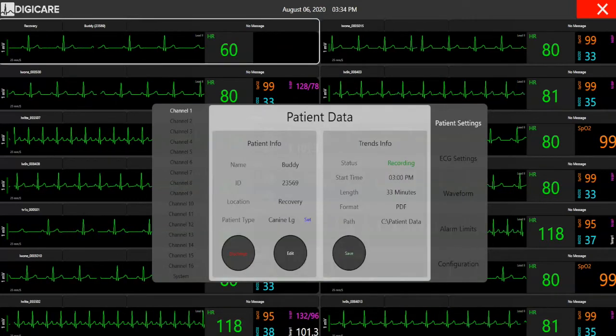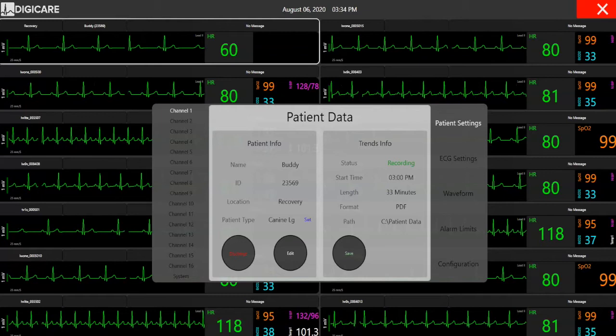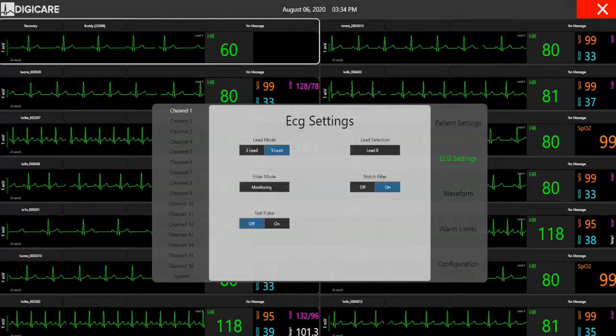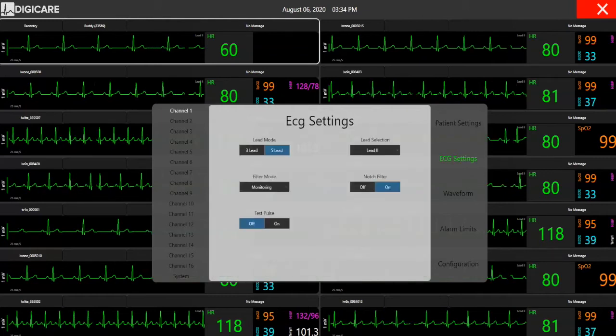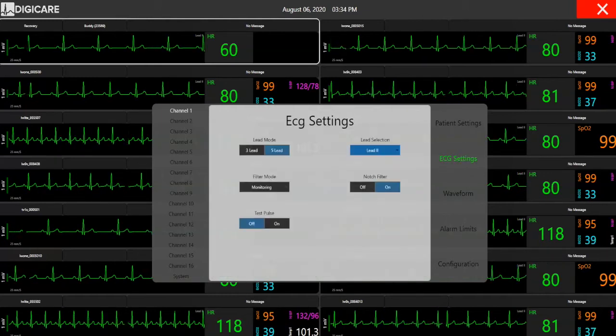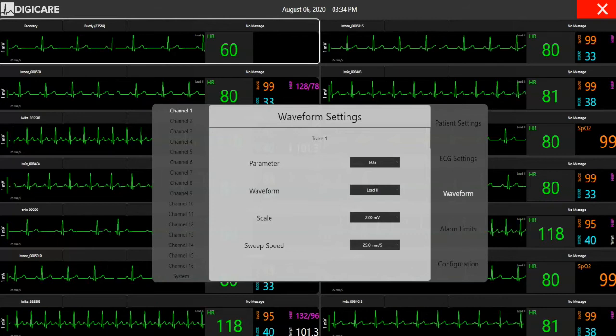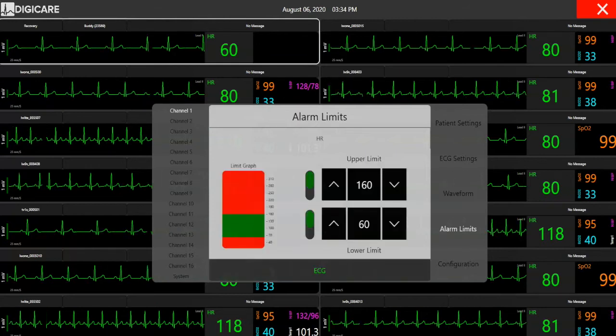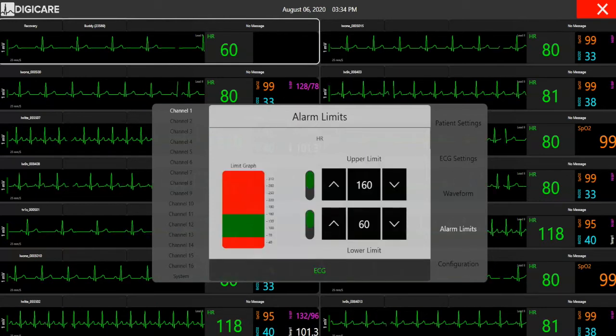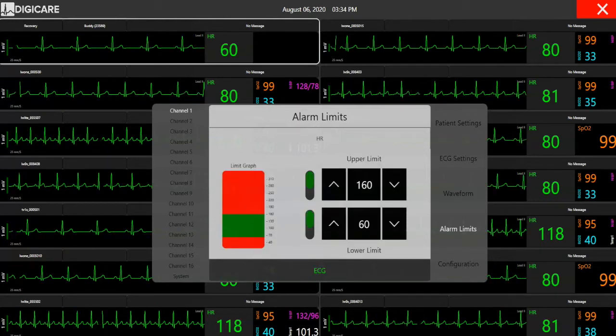On each channel, users can easily access the menu to change parameter settings, waveforms, and alarm limits. Any setting changed on the CentralView will reflect on the monitor.